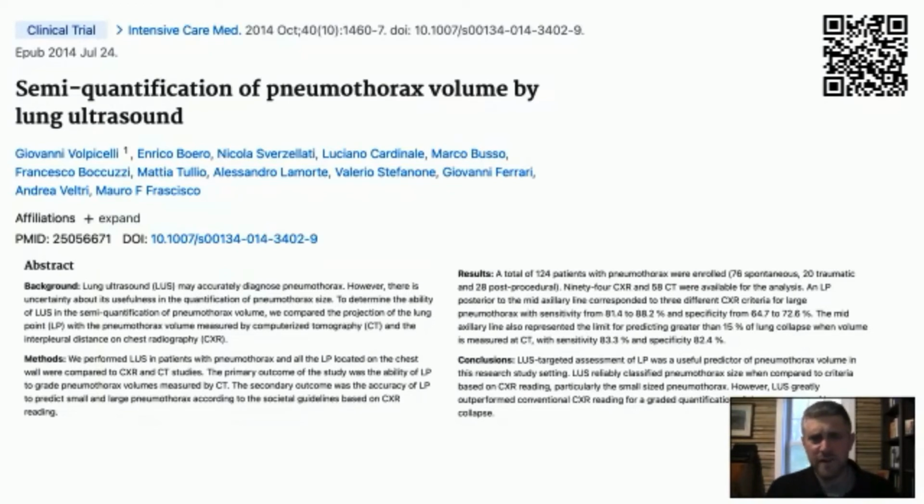So once you've found the pneumo with your scan, you're not done, right? Now you need to move up and down the chest and move laterally to see how big this thing is, to identify, is this something I need to intervene upon here? Or can I defer that for further imaging to confirm that this thing is really, really small?